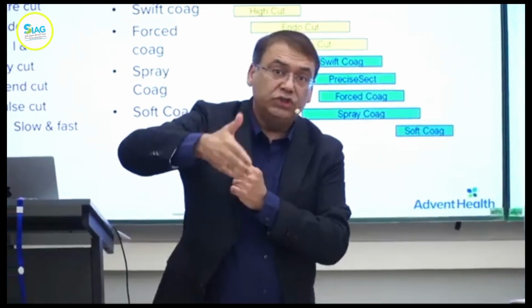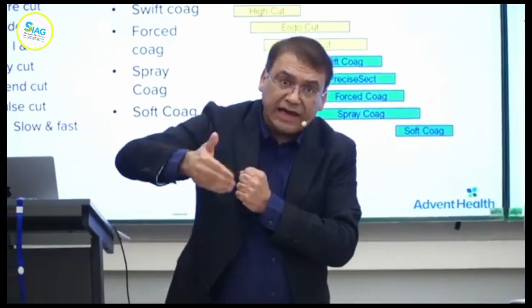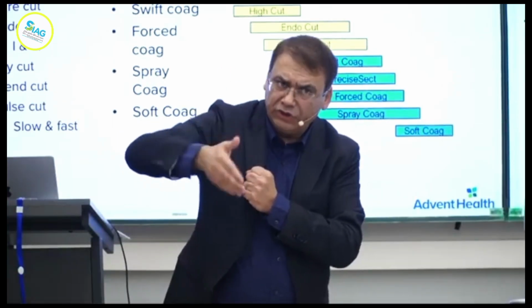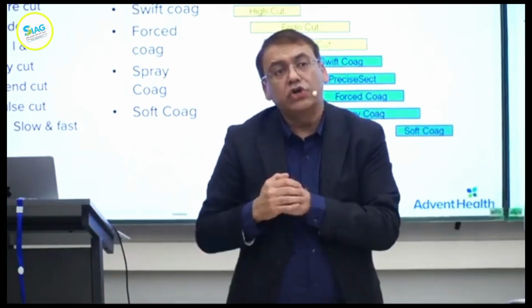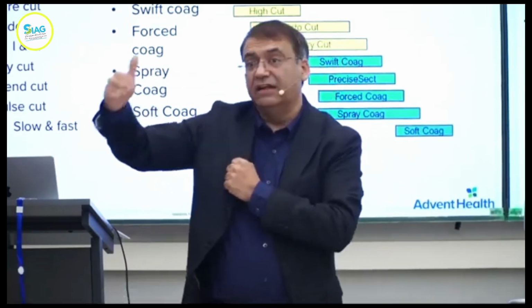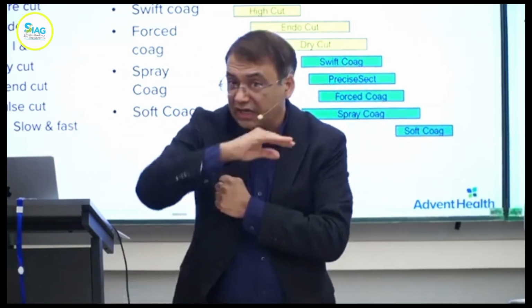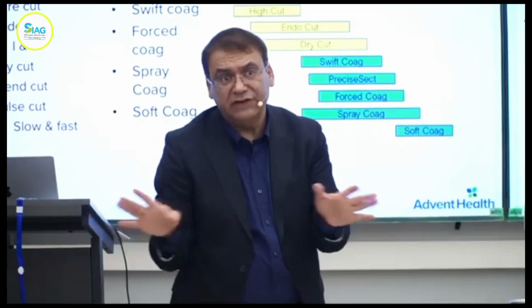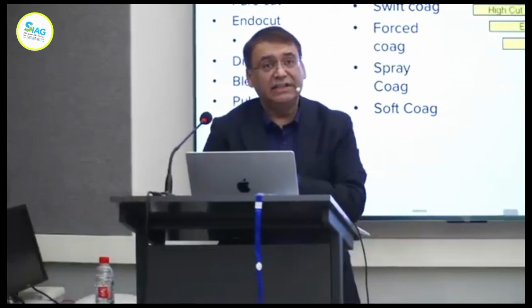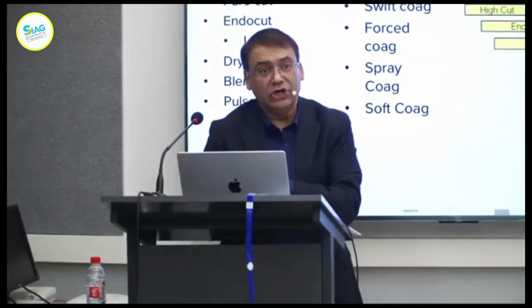So if you want to give a coag during the sphincterotomy, you have to keep the foot on the paddle and let the cycle complete. Otherwise, it's not going to provide any coag. So that's basically the concept. Okay. I think that's how much we really need to know.